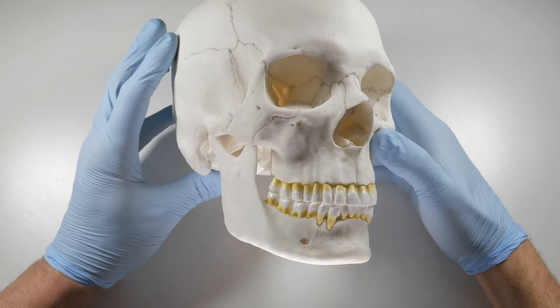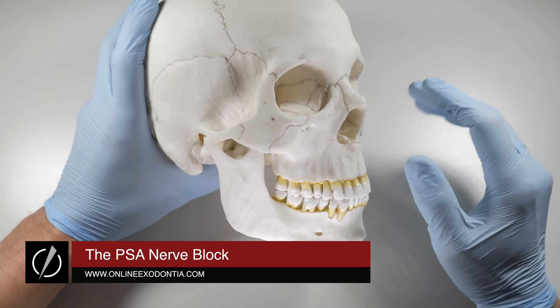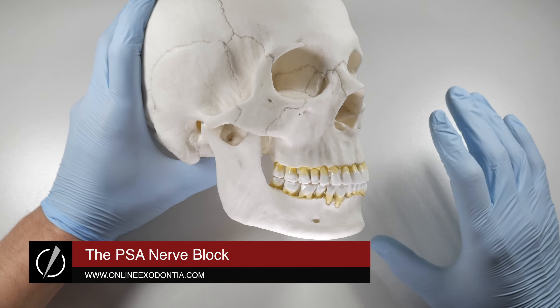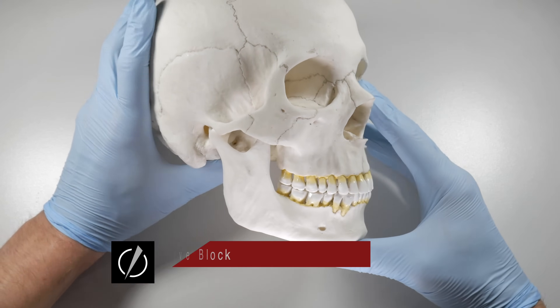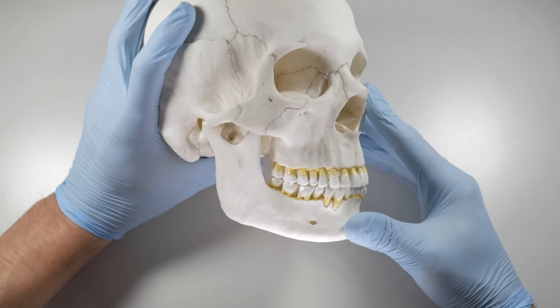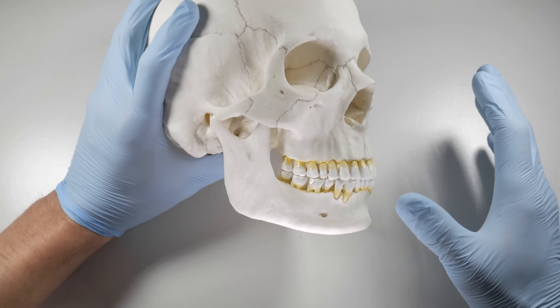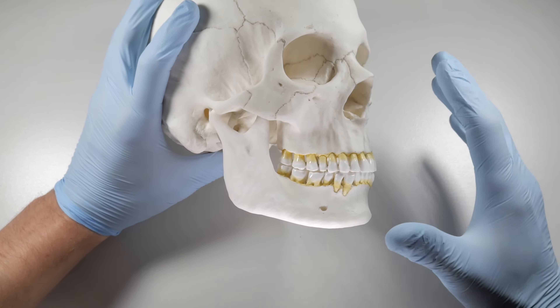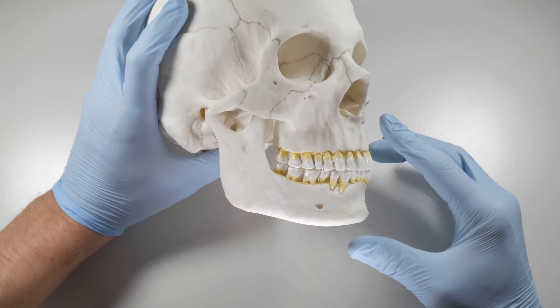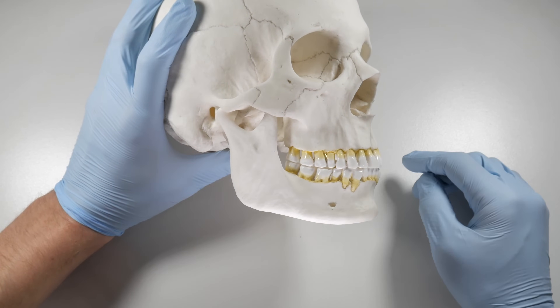The PSA nerve block is a block that I totally avoided when I started practicing dentistry. I was so scared of this block — I thought I was going to cause a massive hematoma, and I just didn't know how to do it because I hadn't had much experience with it. So I stuck with what I knew, I did what was safe, and it was just the infiltrations over these molars. The downside was that I wasn't getting the best anesthesia for my patients, and I was often doing a couple of injections versus just a single block.